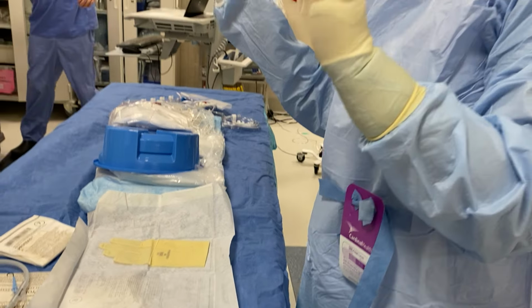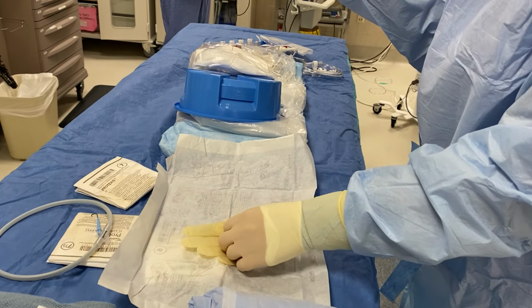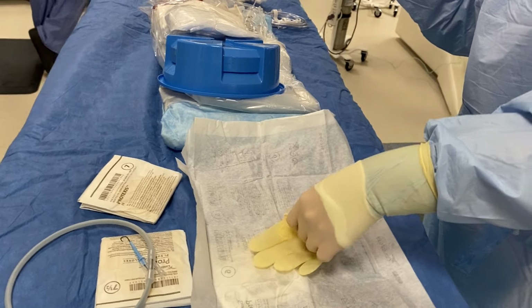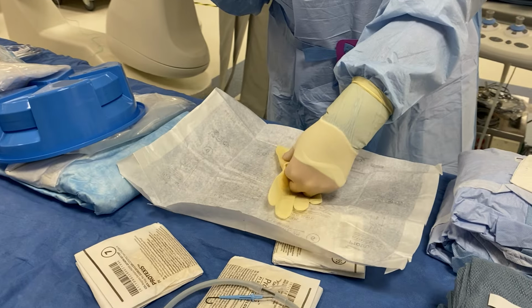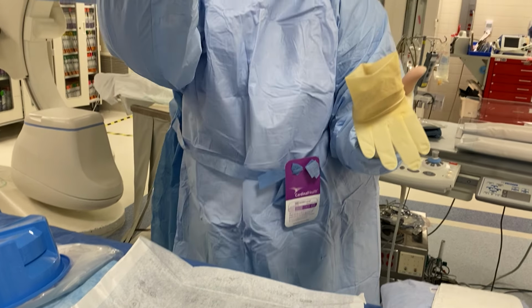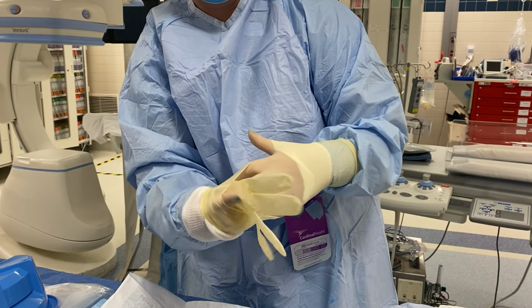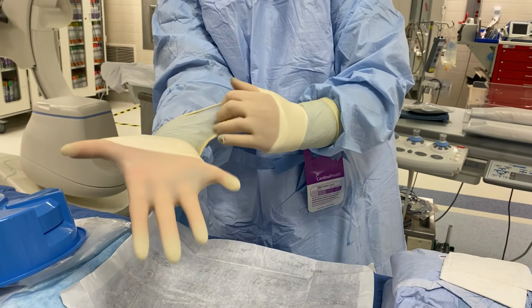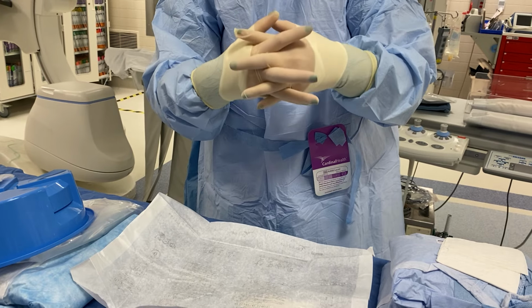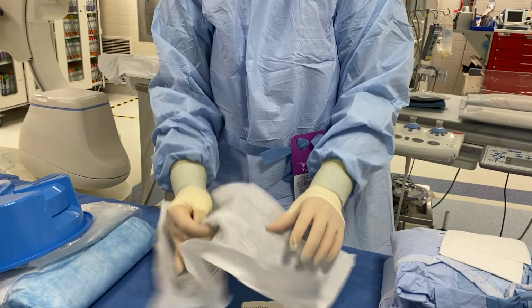Now for the next hand, this hand is sterile, so I can touch. I'm going to reach my fingers underneath the flap to hold the glove open. I'm going to inch my fingers out just a little bit and slide the glove on. Now I can adjust the sleeve as necessary.